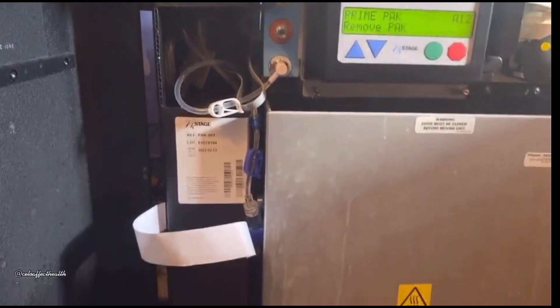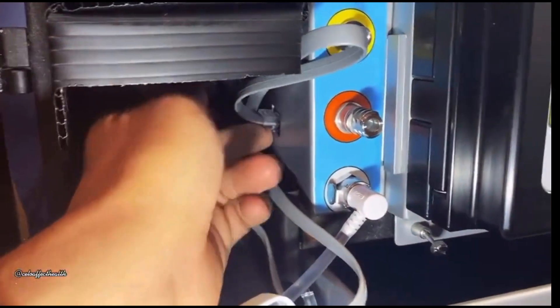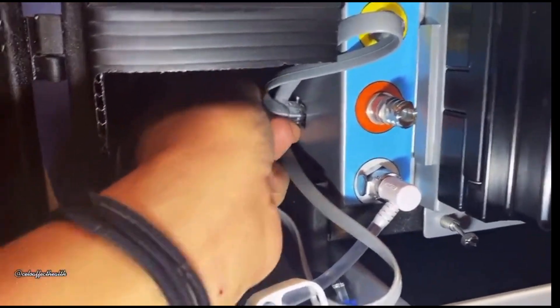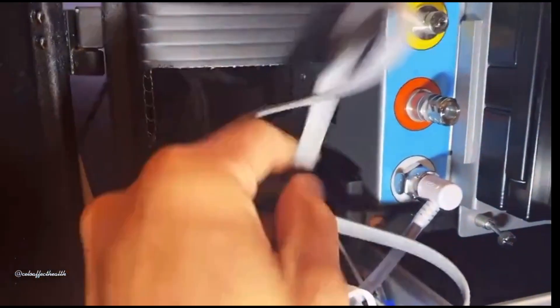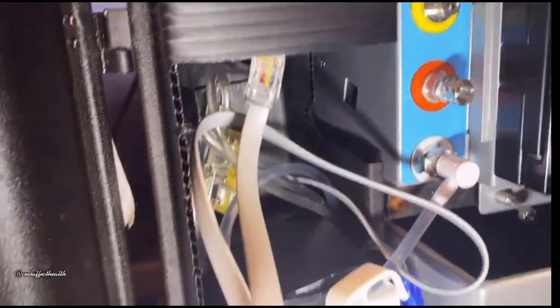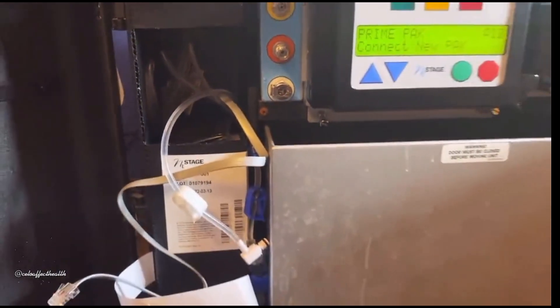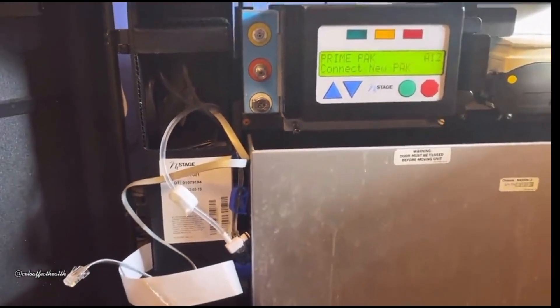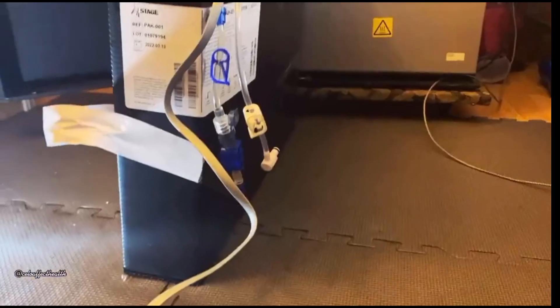First, you must remove the old pack. Clamp the white clamp and remove the dial connection. This can be a bit tricky — take your time. Now pull the pack out with the white strips attached.